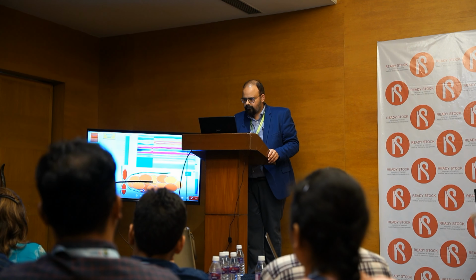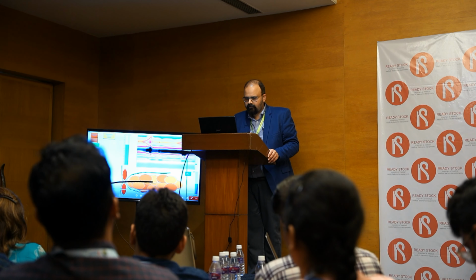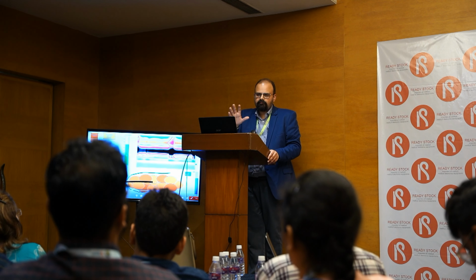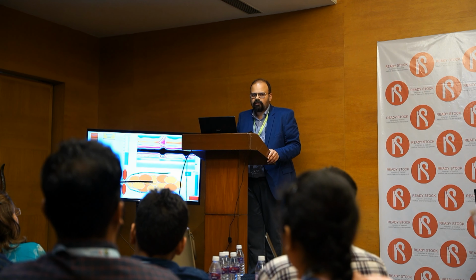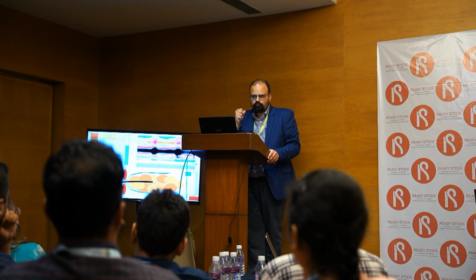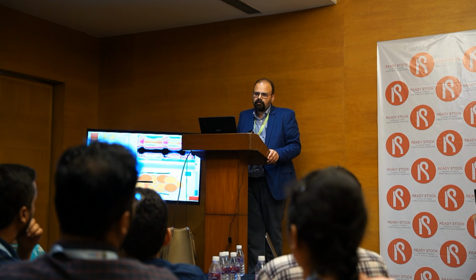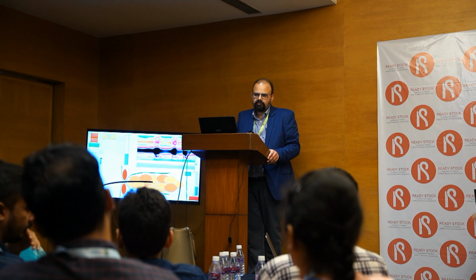I'll show you here. So see, I have increased the anal canal pressures to almost 250 now. This patient's baseline was 120, and when they squeeze it goes up to almost 200, so I kept it around 250. So when they are squeezing, they are really making an effort to squeeze, and then I ask them to completely relax down and bring it down to less than 100 if it is possible. I ask them to focus more on their relaxation than the squeeze itself.